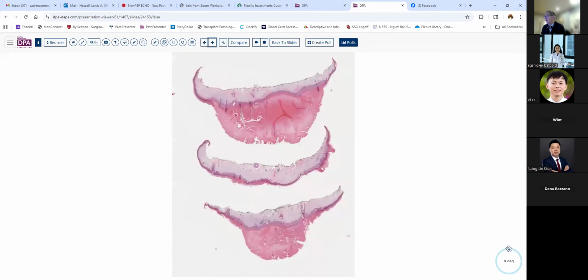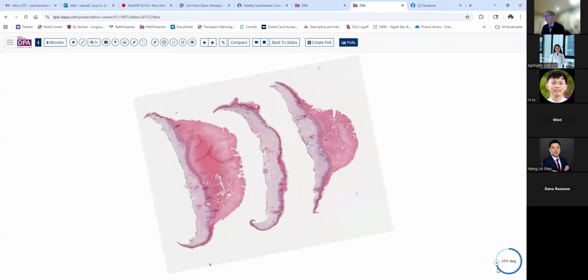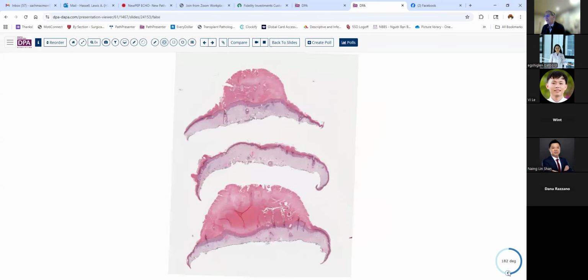And you can see here again we have hyperkeratosis, but I'm going to turn it right side up so that we can look at it more normally. At low magnification, we see this big mound of pink stuff. Does anybody know what this is called, clinically, when you see it in the exam room? What do we call these sorts of things? Papule? That's a clinical term. You're right.